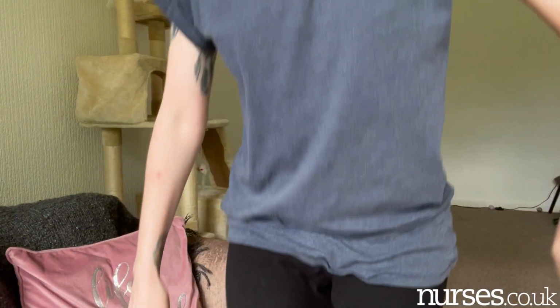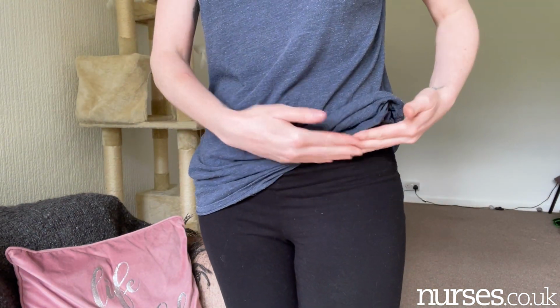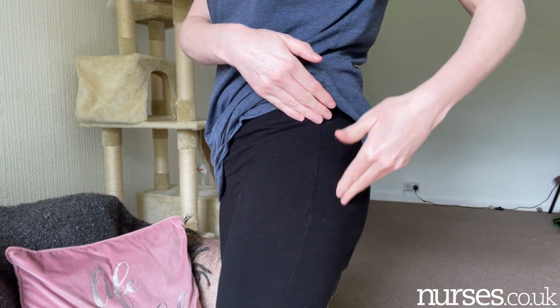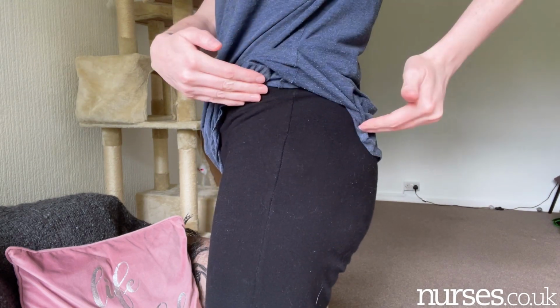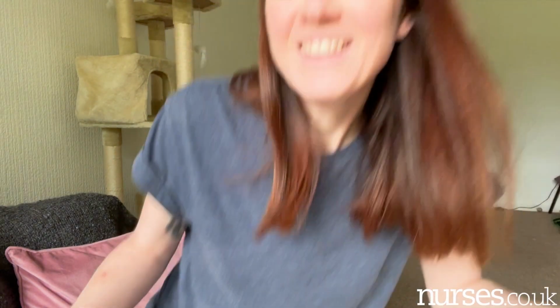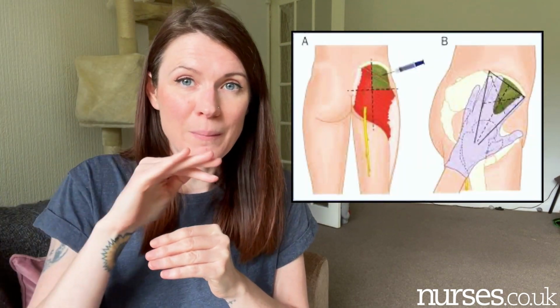And again, for me, the way I work it out is I look for the hip, see where the hip line is, and then there's a triangle shape from the hip to the middle, and you should have that triangle going like that. It's really hard to explain to someone, because visually in my head I can see it, but to explain that is quite hard. But I'm going to put a picture here. That's the kind of triangle area that I'm thinking.